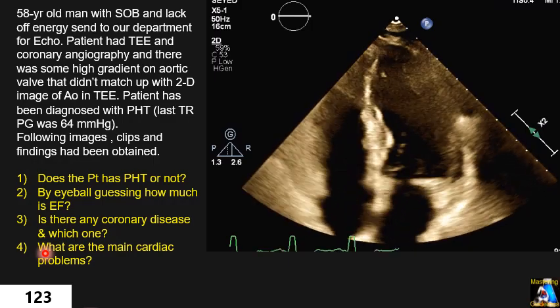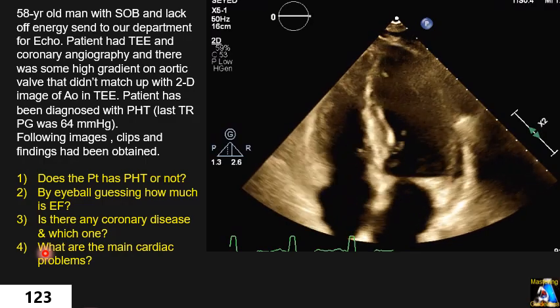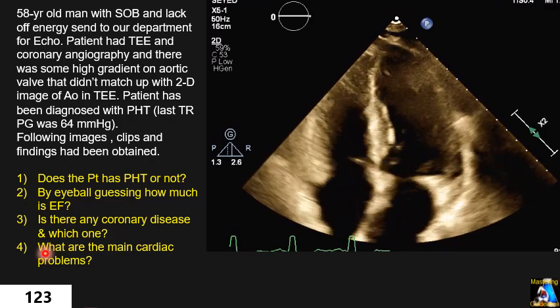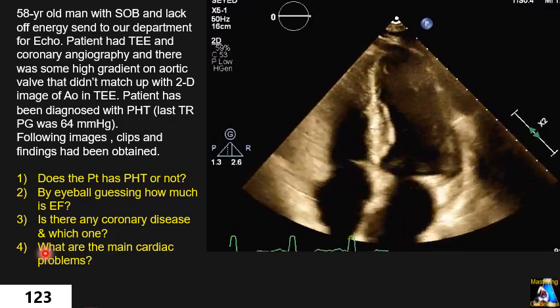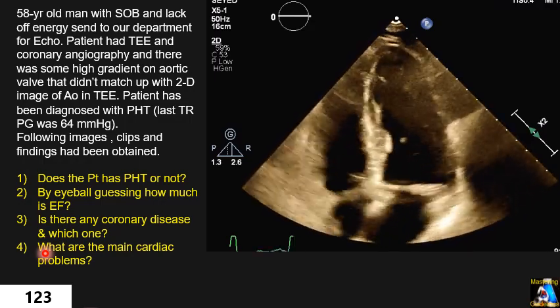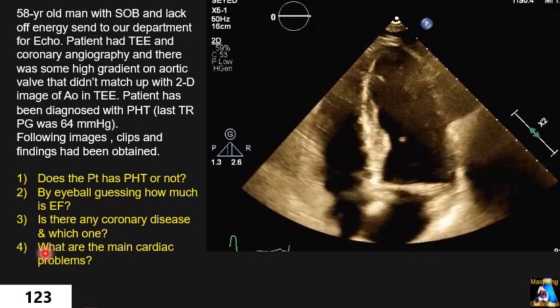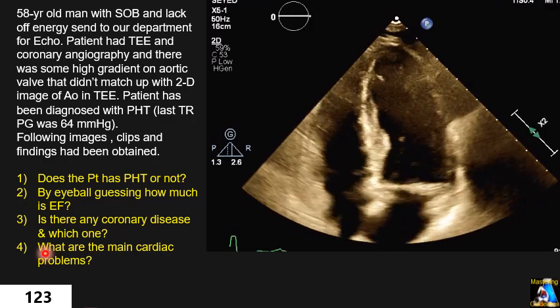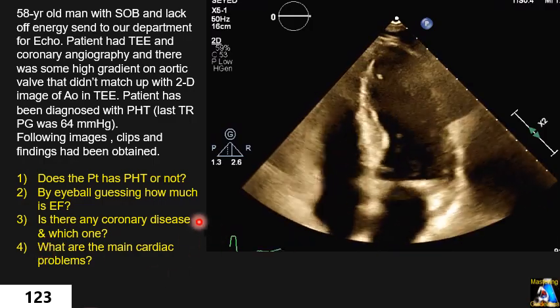In catheterization, they recorded a high gradient on the aorta, but on the TEE it didn't match up with the gradient — because the gradient was over 60, but on 2D TEE it just didn't look like the severe aortic stenosis that I am going to show you shortly.